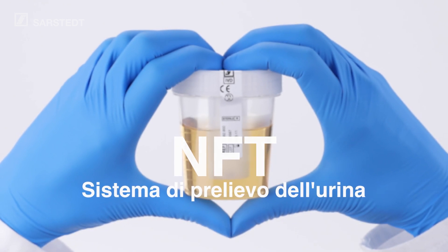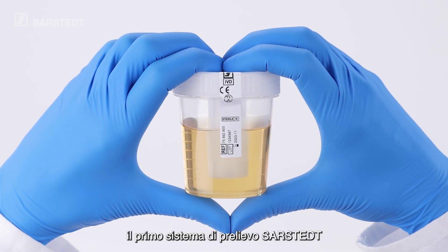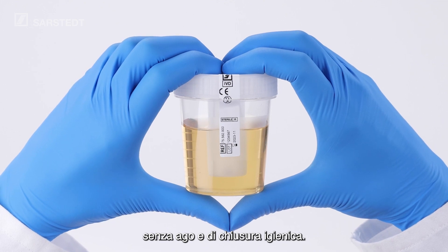The NFT Urine Collection System. Sarsted's first collection system with hygienically enclosed and needle-free sample collection.